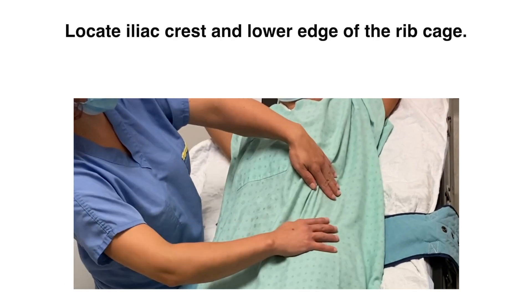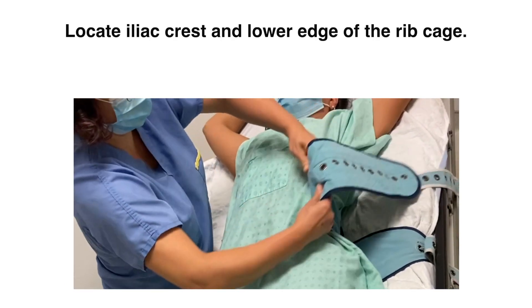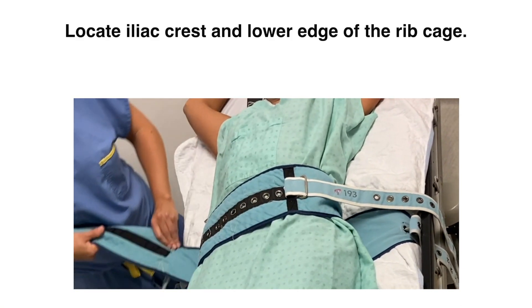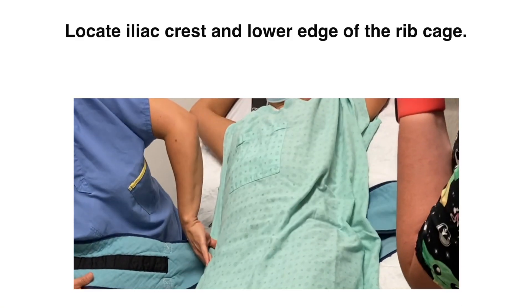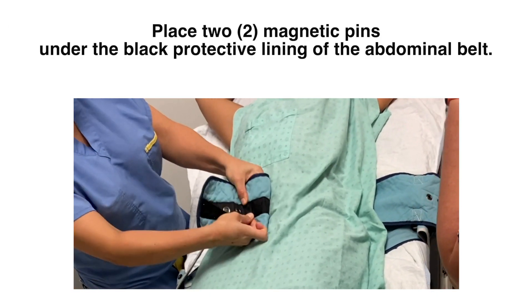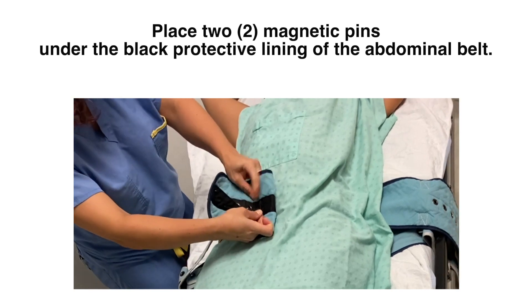To start with, locate the iliac crest and lower edge of the ribcage. Place the two magnetic pins under the black protective lining of the abdominal belt.